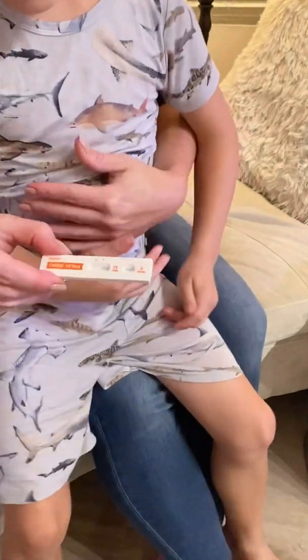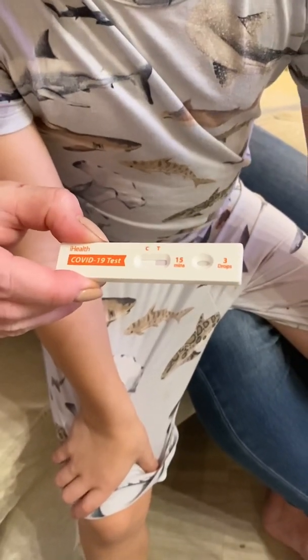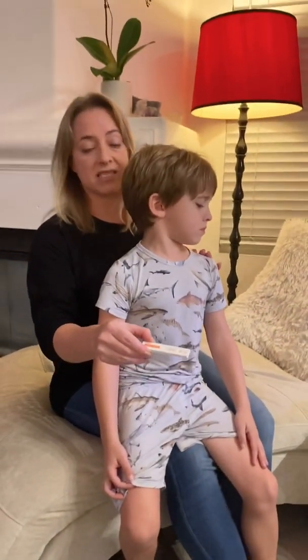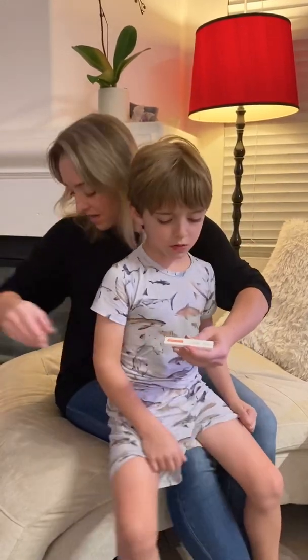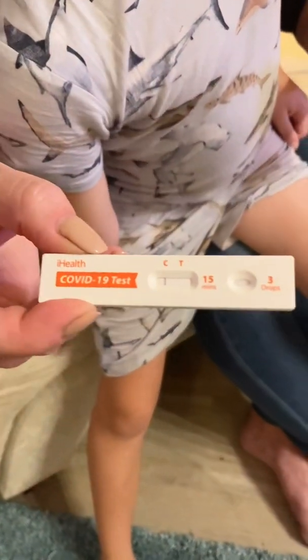One line will mean a negative result. Two lines will mean a positive result. Keep in mind that the second line might be very faint — that still counts as a positive. We did a test two days ago, and I'm going to show you what that card looks like. As you can see, my son has a cold, but his test was negative — there's only one line.